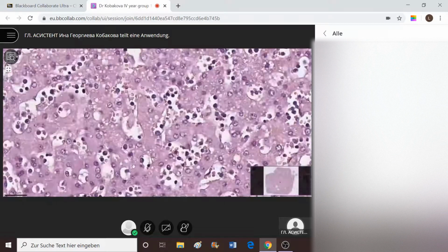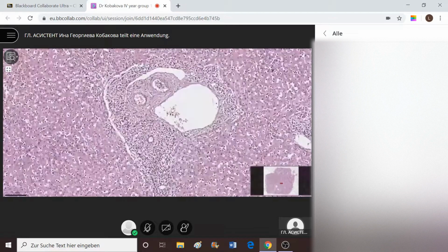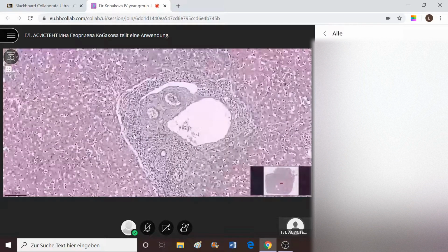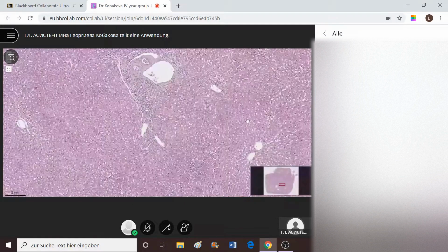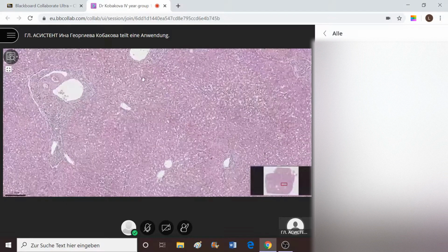And finally, what we observe in the portal tract is that the border lamina is damaged and there is inflammatory infiltrate, which is pretty much predominant here. But we could not call this event hepatitis because we should see definite changes also in the surrounding structures. In hepatitis, we should see necrosis, different types. It should also present with fibrosis. Inflammatory infiltrate should not be this concentrated, unlike in the sinusoid cells like we see it here.